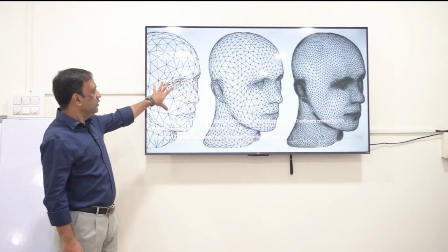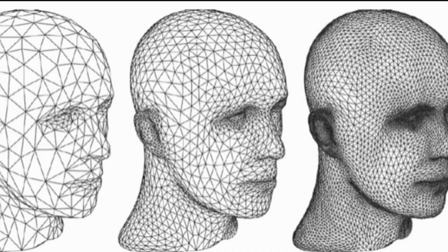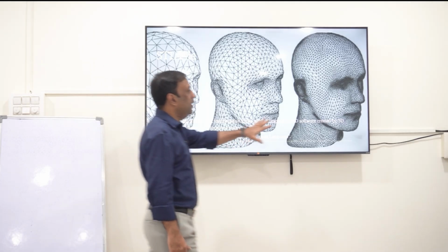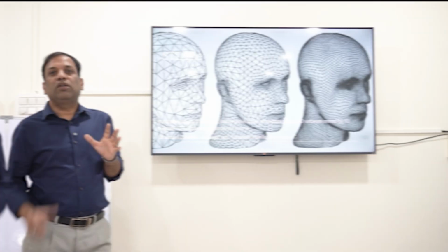If you see over here, this image, this image, this image, the kind of triangles over here. Whatever image quality we are making, that image quality depends on the number of triangles in that image. So HD, high density, is nothing but more triangles in the image. The scanner which can scan this dense triangular image is called the best scanner, having a high resolution or trueness.